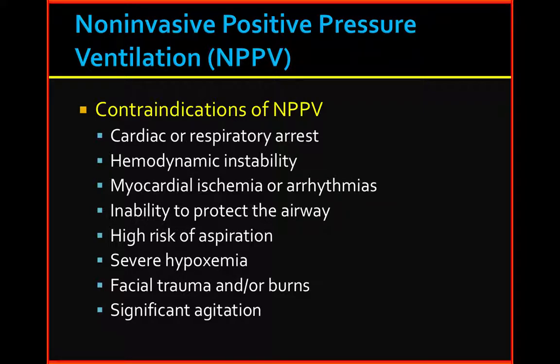The key here is that the patient triggers the vent. How does that happen? Well, the patient takes a breath in, and therefore there's a negative pressure here, which causes a negative pressure to be sensed here at the ventilator. The other way you could sense it is by flow, if there's a flow that actually goes through here by the negative pressure. Now, as soon as the ventilator picks up on that negative pressure, it's going to deliver a specific volume.